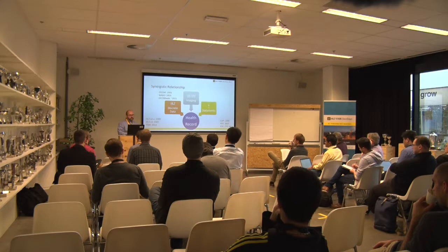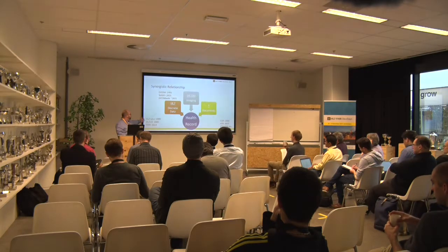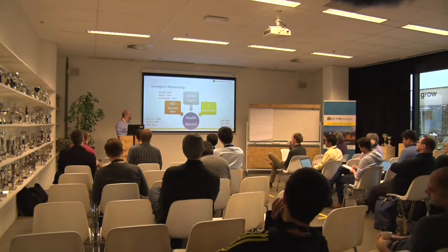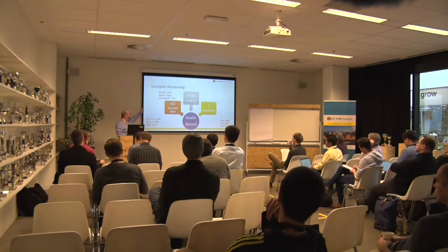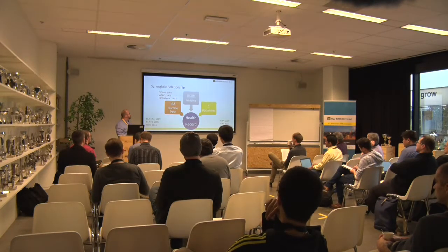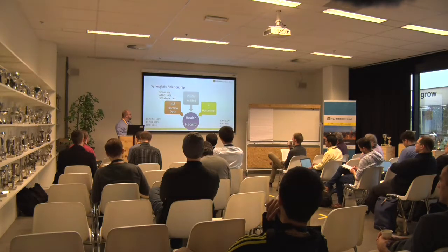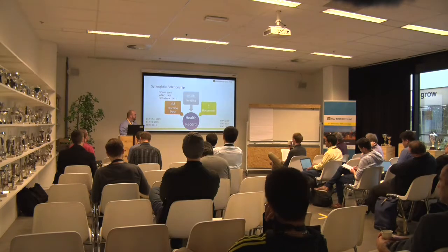And we've got a number of standards that have evolved over the years to actually capture this. So in HL7 we had version 2, which is in 1989. Version 3 came out later, and then FHIR later than that. In DICOM, we had the first official spec of DICOM in '93, WADO, which is web access for DICOM, 2003, and then DICOMweb started in 2011. And then in terms of documents, CDA has been there, XDS, and we've always had things like PDF and TIFF and others.